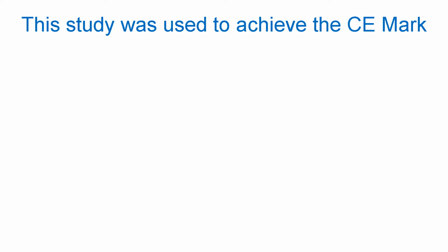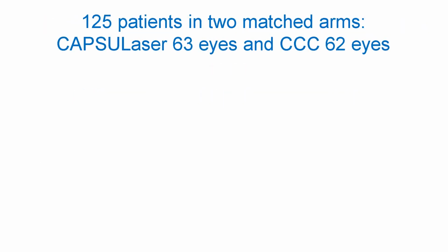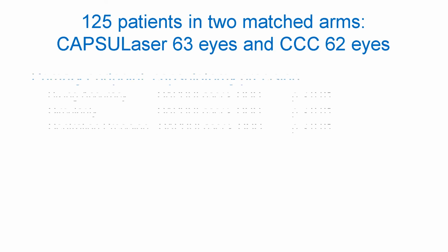And this was a study that was used to achieve the CE mark, where we looked at the efficacy and safety of a new selective laser device to create anterior capsulotomies in cataract patients. And this was published in the Journal of Cataract and Refractive Surgery in 2019. The study consisted of 125 patients in 2 matched arms. The CAPSULaser arm had 63 eyes, the CCC arm had 62 eyes.